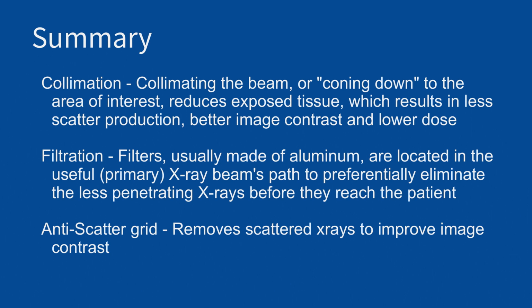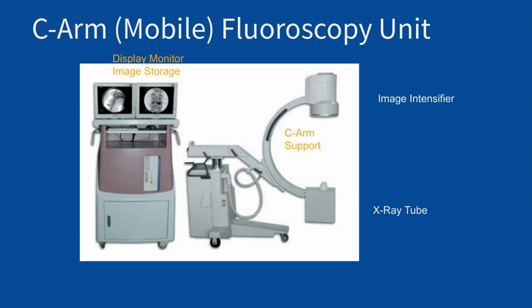Last, we have this anti-scatter grid, which is on the far side of the X-ray tube. And this is really there to remove any scattered X-rays. Again, scatter is what generates noise. So by removing scattered X-rays, we reduce that noise. But do remember that you can get this grid artifact, which is a mechanical problem with how the scatter grid seats in the detector.